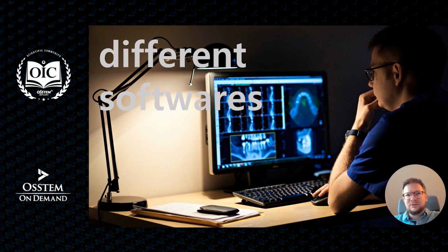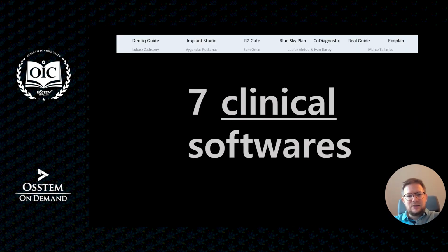Why is this interesting? Because for the planning we are using different software, and what I found out is that those softwares are very different from each other, and also with a group of friends I found a lot of voids or things which are not developed well within the software. And what I'm showing today is the outcome of the project regarding analysis of 7 clinical softwares for planning.